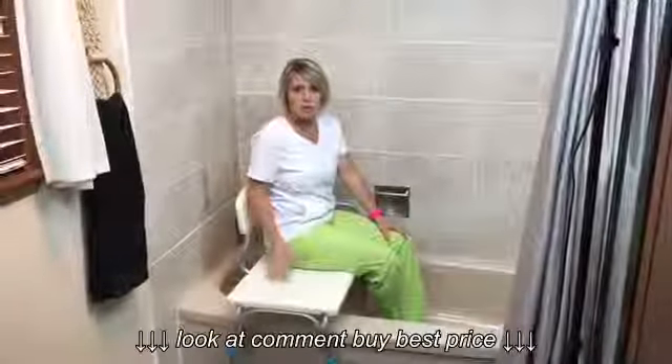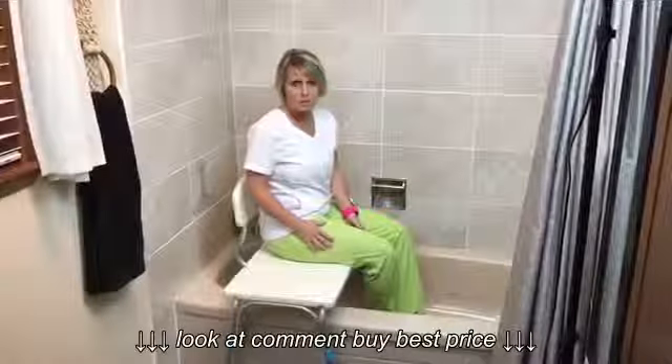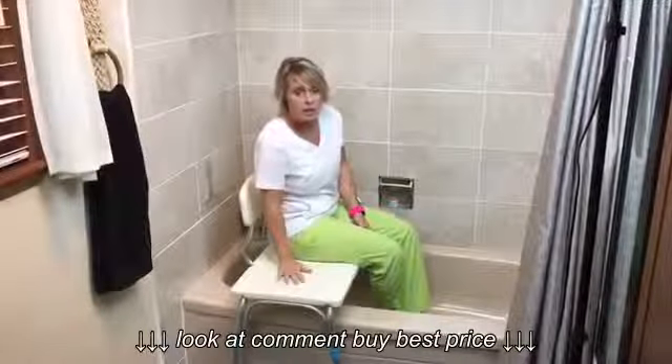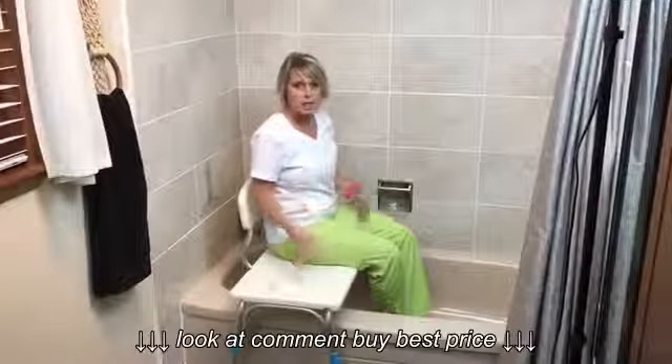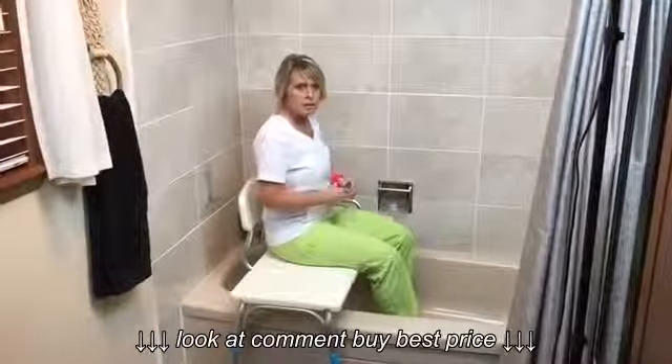As you can see, the transfer is pretty simple on a bench like this. The things I don't really like about this version are that it's pretty hard and cold when you first get onto it. Also, with the sliding, as people age their skin gets more fragile and it could cause some skin tearing. The other thing is that twisting might be hard on the hips and the knees.